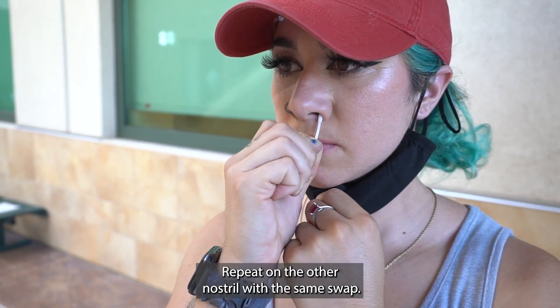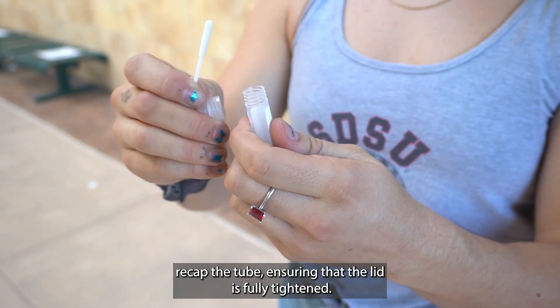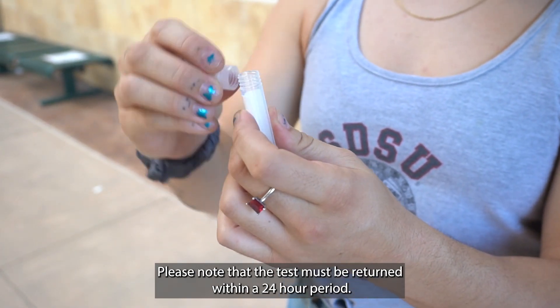Repeat on the other nostril with the same swab. Uncap the tube and place the swab tip-down into the vial. Recap the tube, ensuring that the lid is fully tightened. Please note that the test must be returned within a 24-hour period.